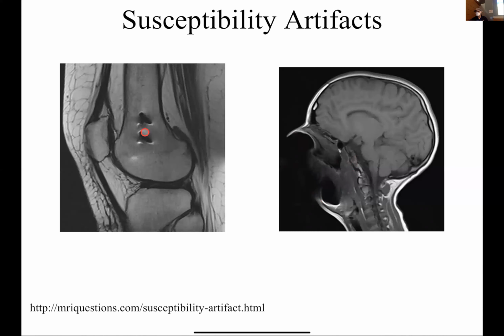In this case, there's probably some metal implants. And whether this person should have gone in the scanner or not depends a little bit on the safety criteria of the implants. But in general, we try to limit people to titanium implants or things like that. And if this was steel or ferromagnetic, it would obviously also be very dangerous for that person. Okay. But in any case, these people, when they were imaged, clearly had metal that was causing these imaging artifacts.